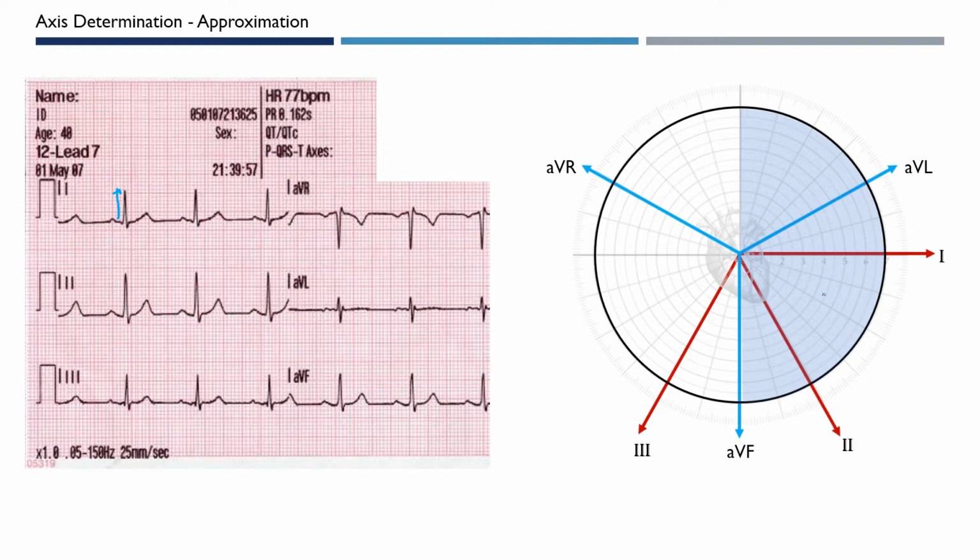So over off to the right, you can see that anything that is 90 degrees from lead 1 is now highlighted in blue. That doesn't really give us much. However, if we combine this with other leads, in our example, if we use lead 3 now, we can combine the two of these to look where the areas overlap. In this case, we also have a depolarization, which means that we know electrical activity is moving towards lead 3.